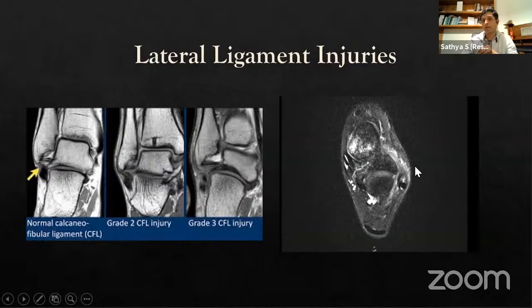Here is one of the MRIs of a young patient of mine. She's only 16 years old, a full-on long-distance runner, who ended up rolling her ankle, landing on a small rock, and developed this anterior ankle pain. When I was assessing her, she was very tender at the junction on the head of the talus.